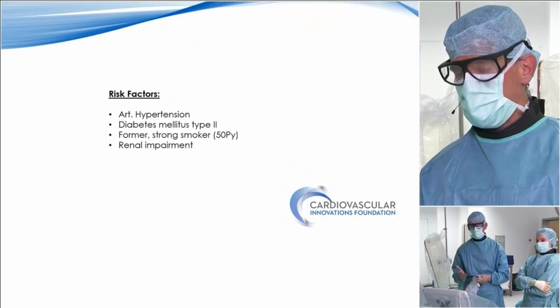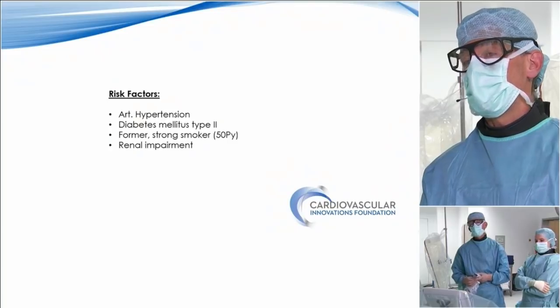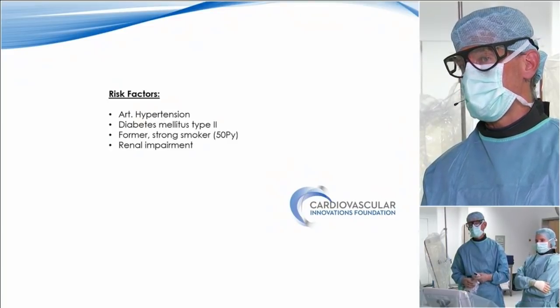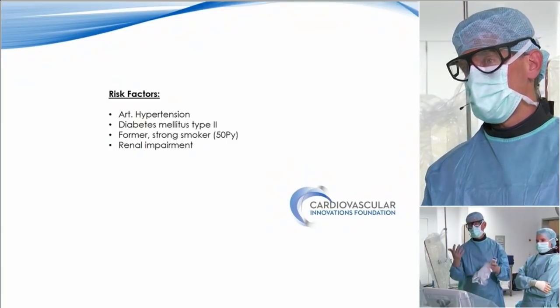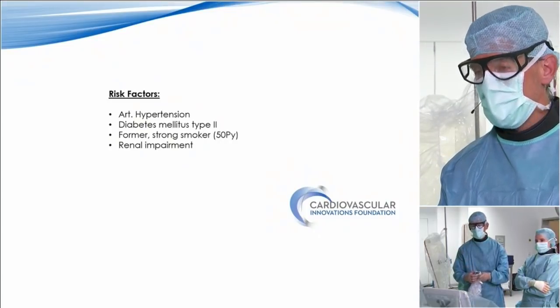And well, I wanted to mention also this. Of course, this is a sign for being quite sure that the SFA is cut off. If you do not have the report, of course the calcium at the proximal part is missing.